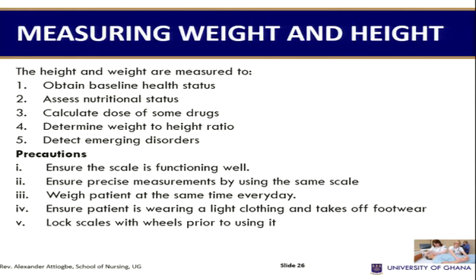Precautions. Ensure the scale is functioning well. Ensure precise measurement by using the same scale. Weigh the patient at the same time every day. Ensure the patient is wearing light clothing and takes off footwear. Lock scales with wheels prior to using them.